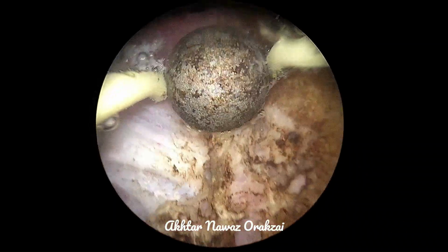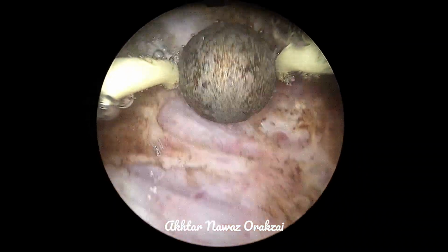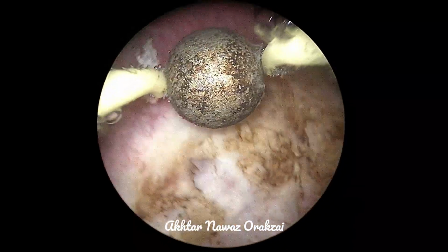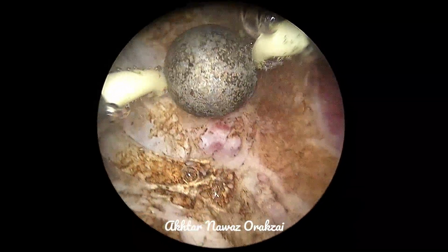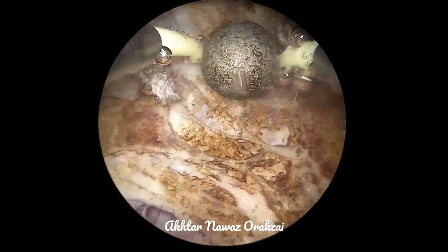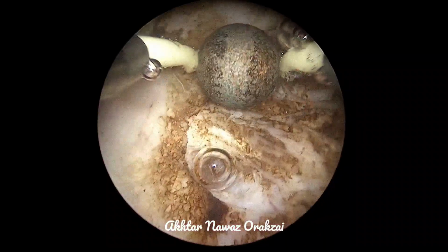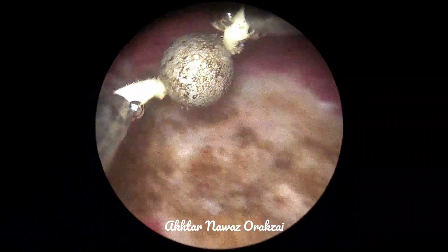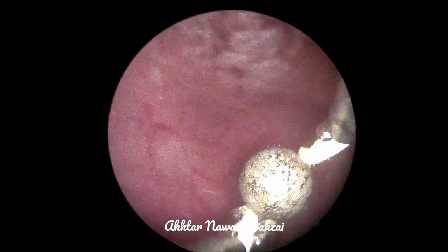These redness areas seem to be carcinoma in situ, but they are not carcinoma in situ because they were not present when we did cystoscopy. So these red areas are because of the trapping of bladder mucosa in the Ellik evacuator.